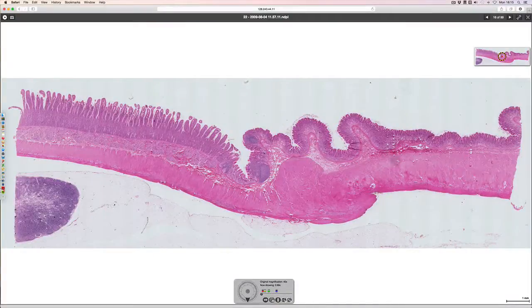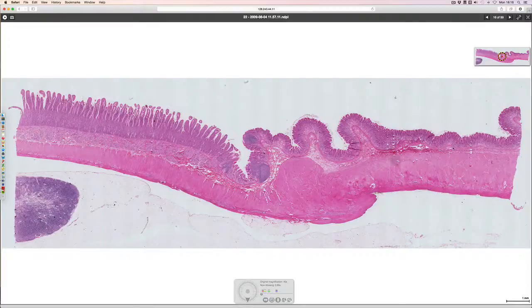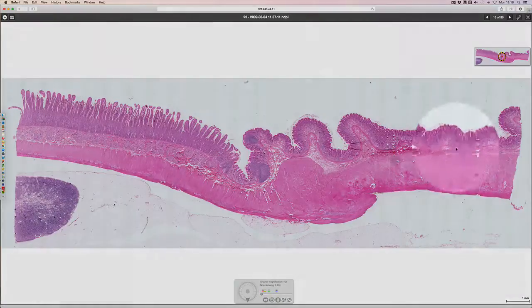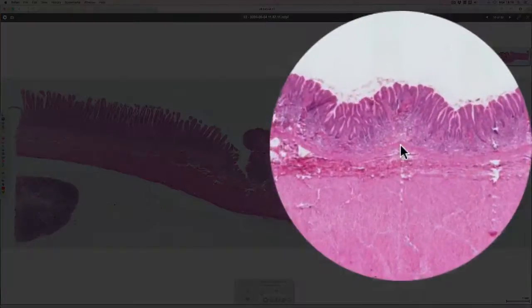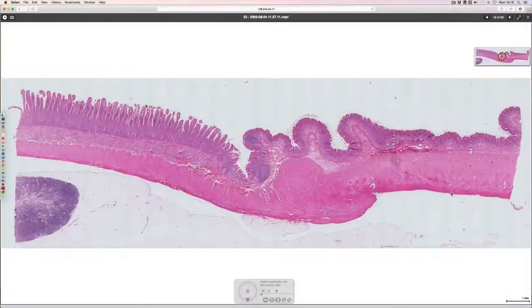This video is demonstrating the change in mucosa from the stomach to the small intestine. In this area we have the mucosa extending to the muscularis mucosa, a submucosa, and then the muscle surrounded at this point by a serosa.